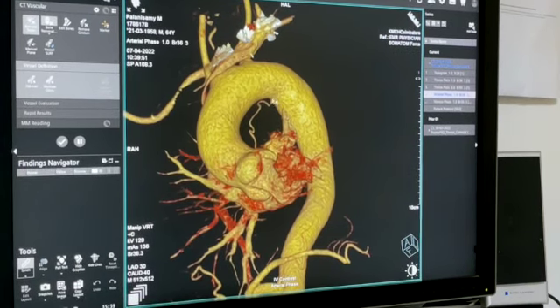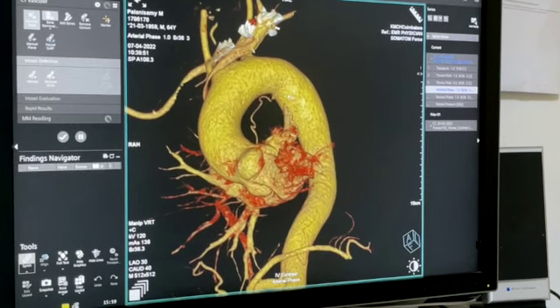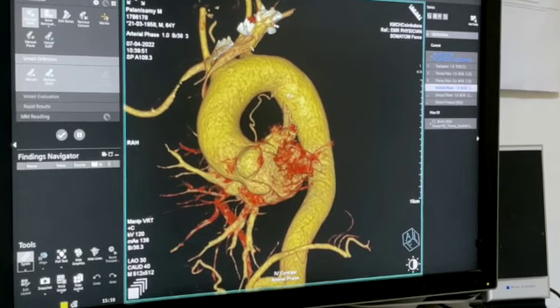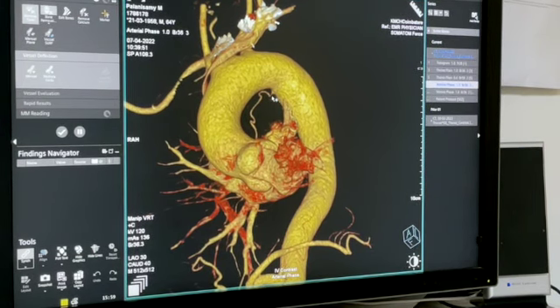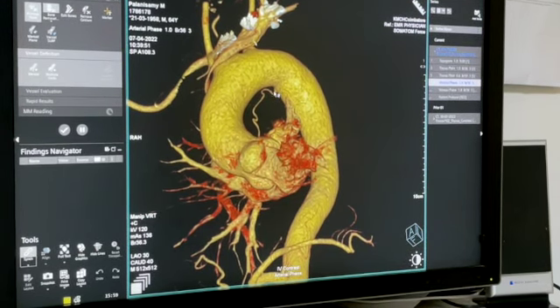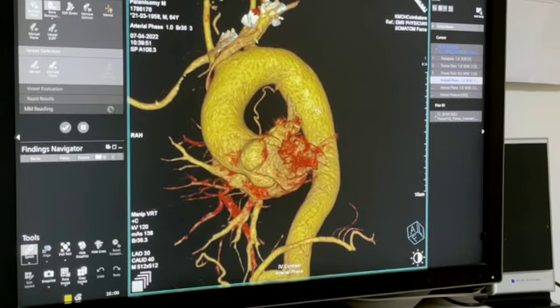Now you know, if I keep this patient on a flat AP, if I take the tube to an LAO of 30 degrees and give a caudal angulation of 40, I can actually hook this vessel and do it. LAO of 30 and a caudal of 40. Now which catheter would you choose?